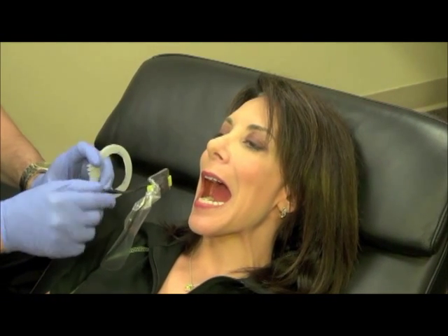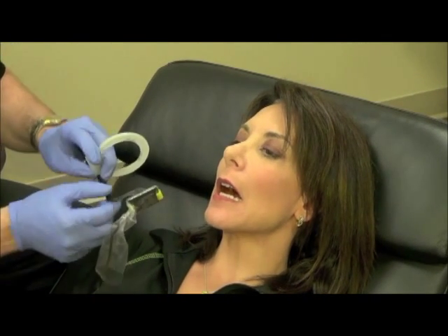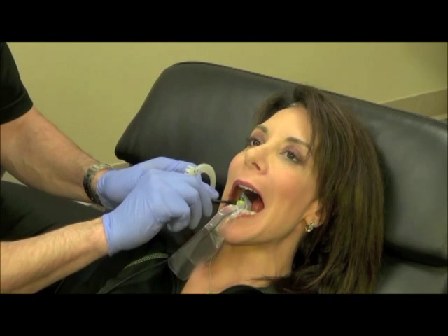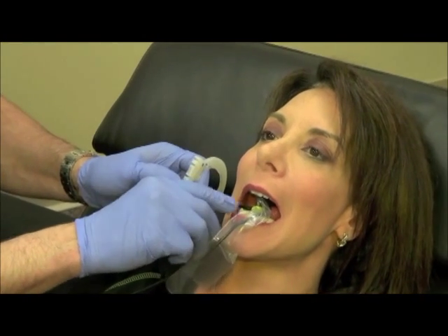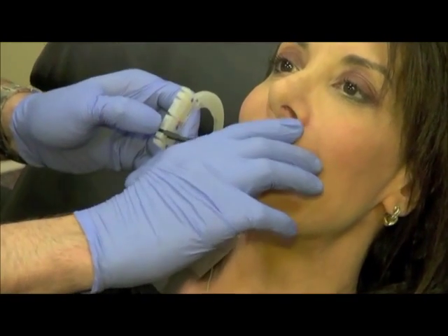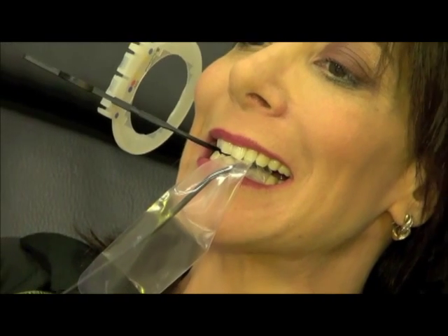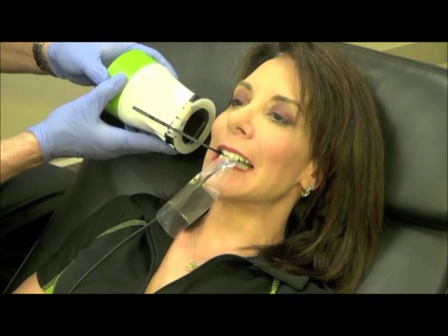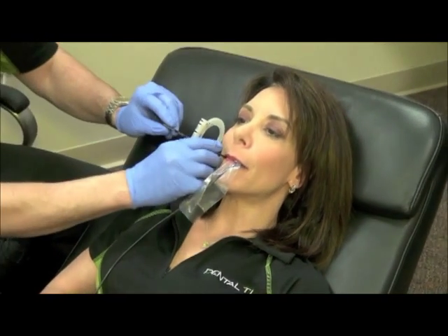I look at the patient's contacts and I want this grid to align with those contacts. The lines going perpendicular to the sensor should be bisecting the posterior mandibular contact. I've placed the biting surface down on the mandibular occlusal surface with the sensor in the middle of the patient's mouth. The patient slowly closes, and now we've got the correct alignment to get the posterior mandibular contacts open. Here we would be flush with the x-ray alignment ring and the x-ray tube, and with that arrangement we will get those posterior contacts open.